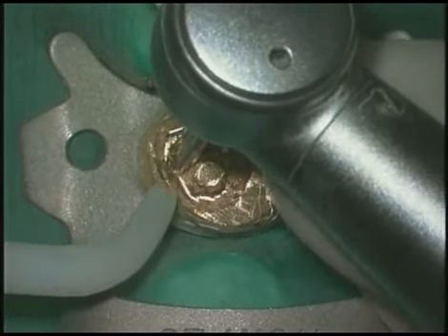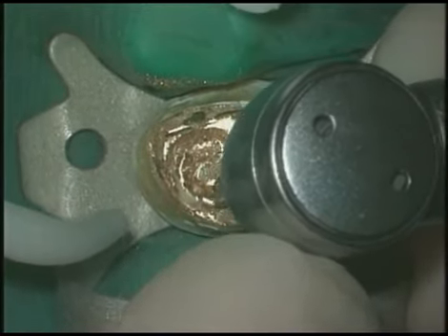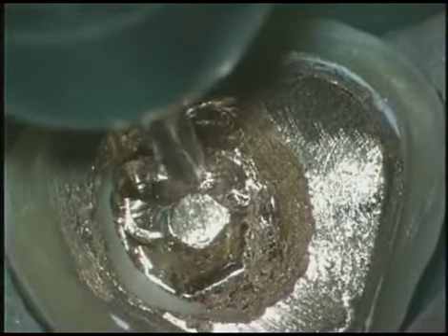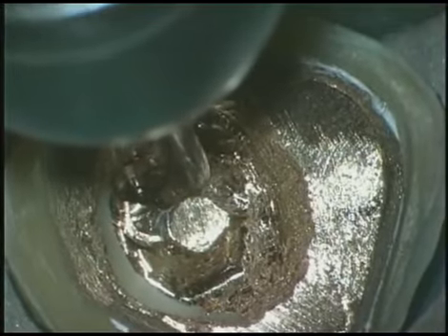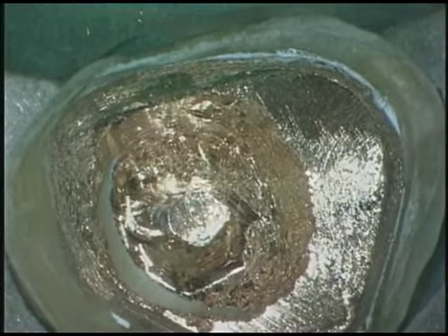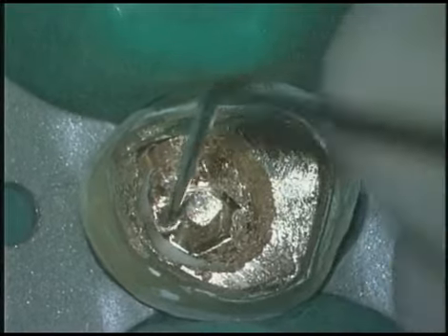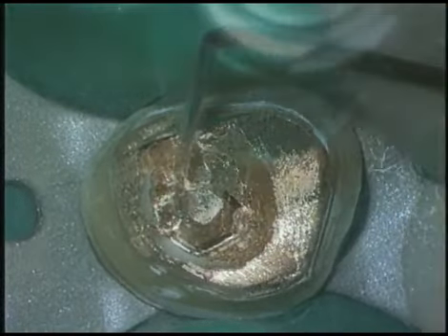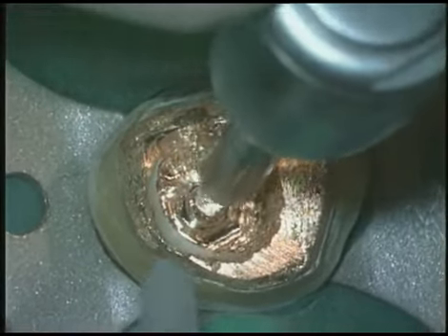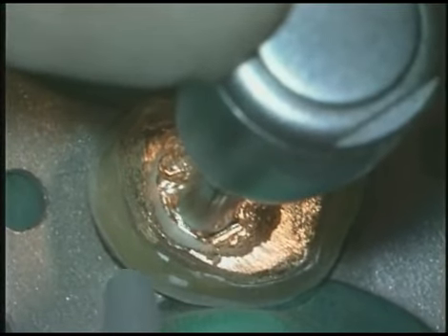By removing the core down 2 or 3 millimeters, we begin to expose the post, but frequently there'll be a very thin onion skin layer of core still present around the actual post. This is seen here with an explorer. Don't really waste a lot of clinical time here because we can immediately go to a trephine, and going from big to small, we can reduce that post and throw off all the residual core that was around the post.